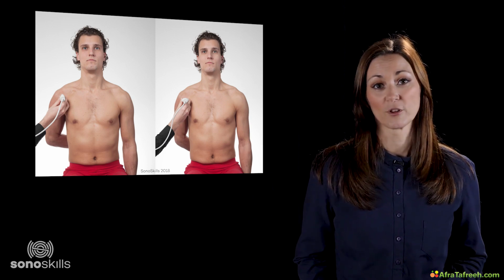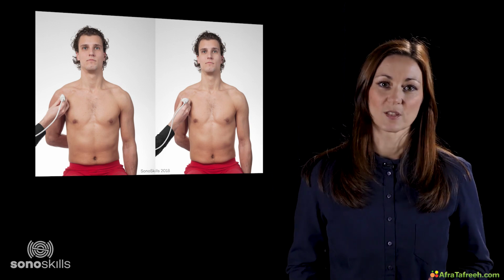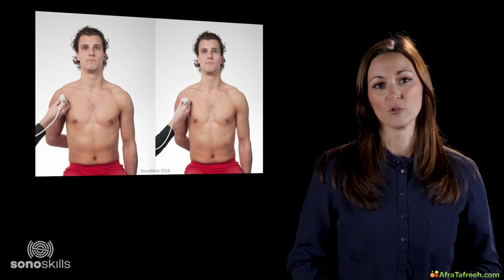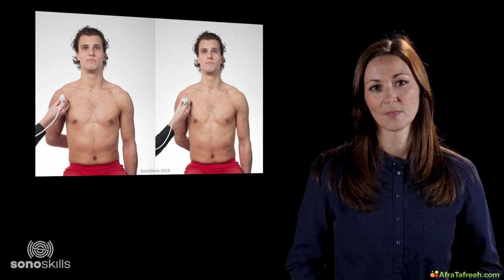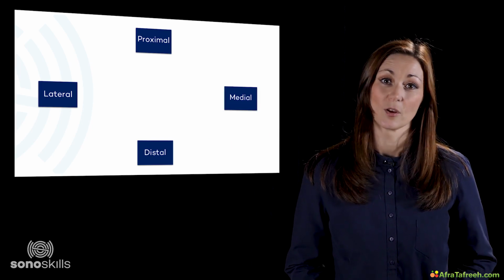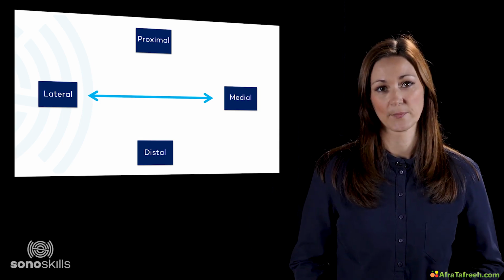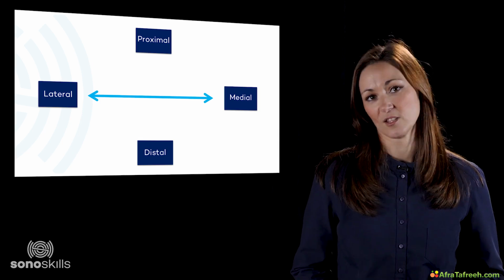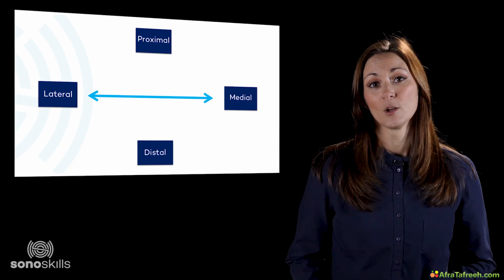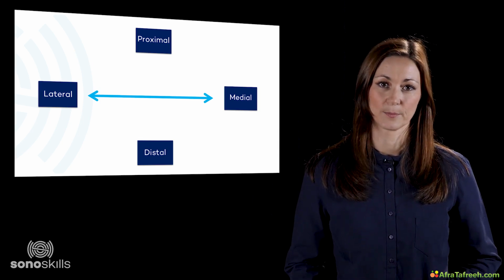The full internal rotation twists the supraspinatus into a vertical position with its fibers orientated proximally to distally. If we take the new fibre orientation of the supraspinatus into account, we need to place the transducer on this ventral shoulder in a horizontal way. Orientating the transducer laterally to medially will visualise the transverse or short axis of the supraspinatus.